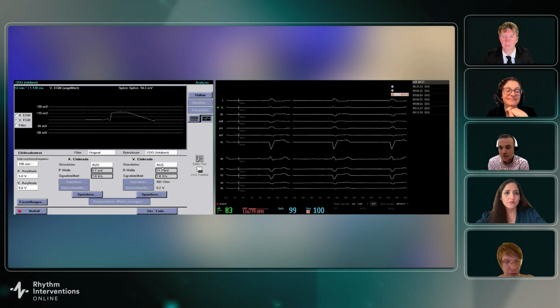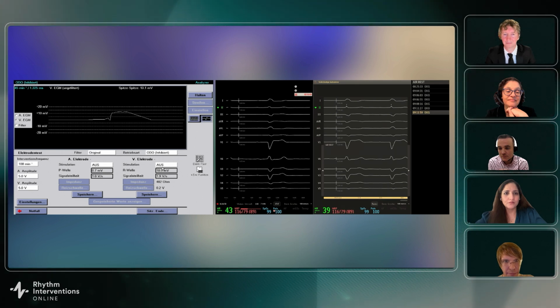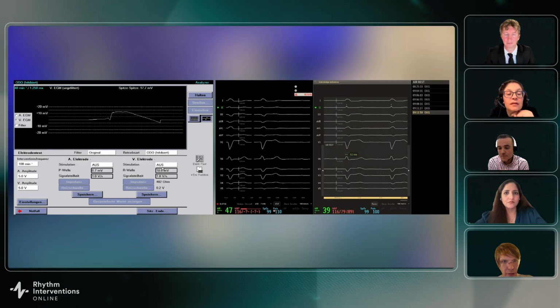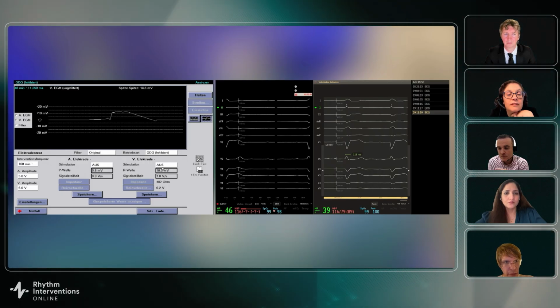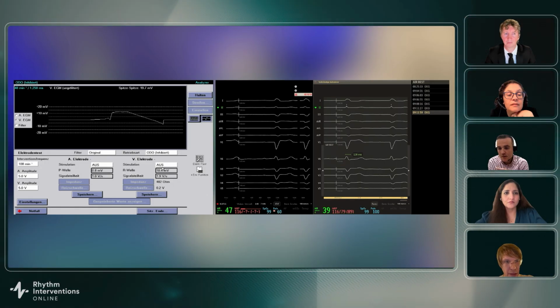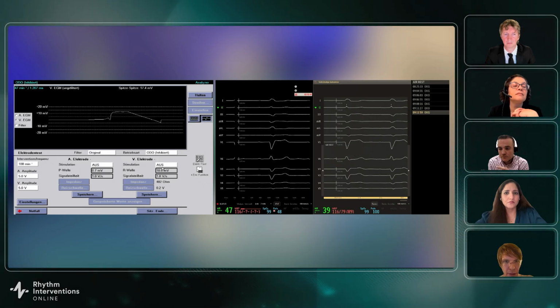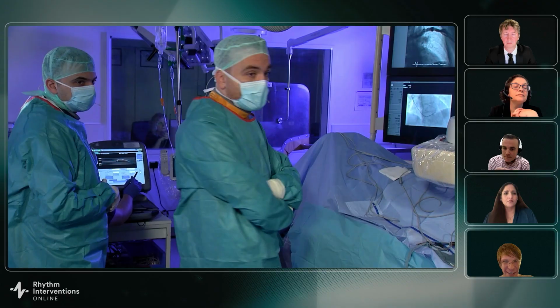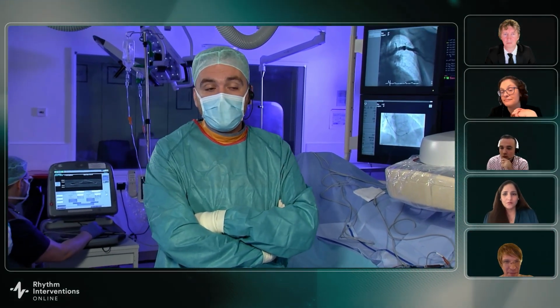I'm not completely sure that we are actually seeing the proof of conduction system engagement. But before the main curve, we also see a small bump, which could indicate injury of the conduction system in the current of injury panel. I'm not completely sure, but definitely in patients after TAVI, LBB is a good strategy. So I totally agree with you.